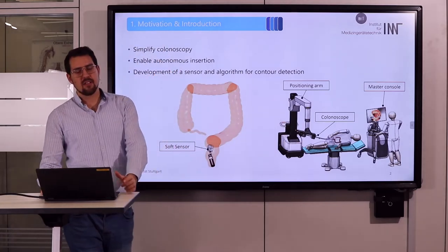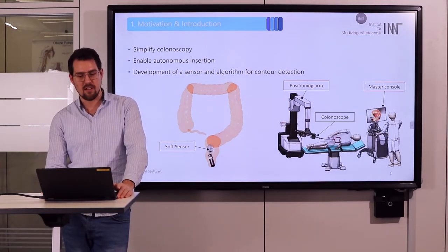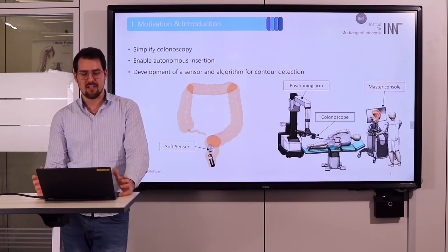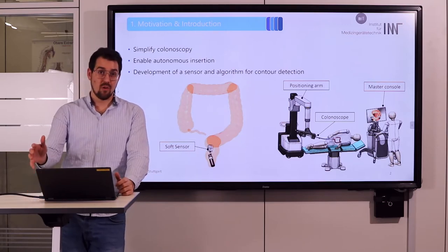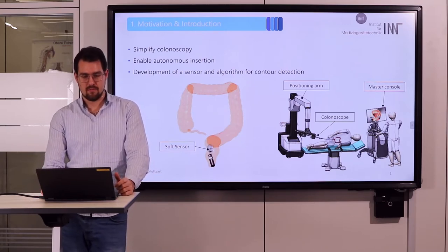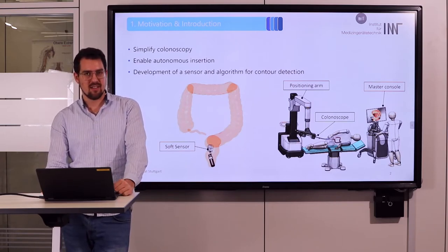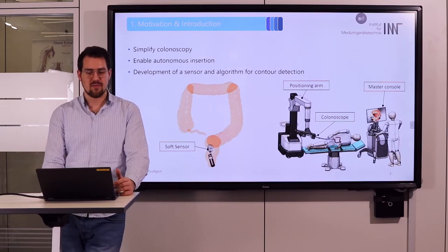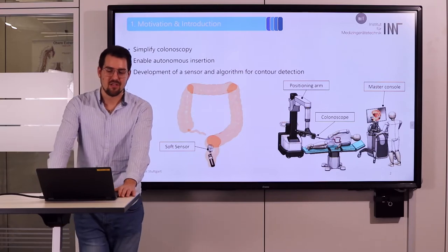We want the insertion of the colonoscope to be simplified and done more or less autonomously, so the user at the master console just gives the input forward or backward. However, the robotic system must recognize the contour of the intestine to capture the curved pathway and enable injury-free and painless insertion of the endoscope.